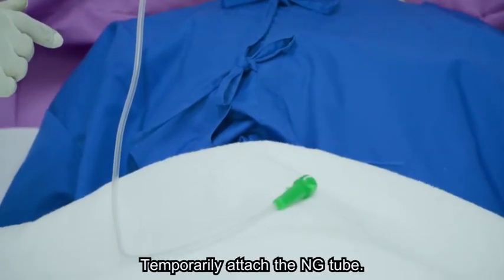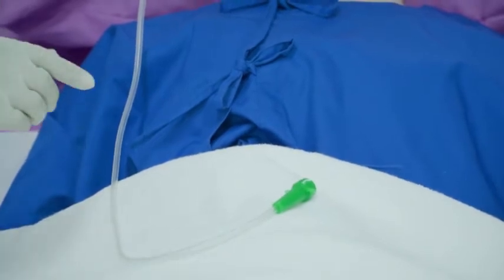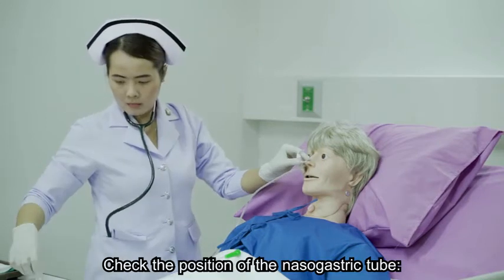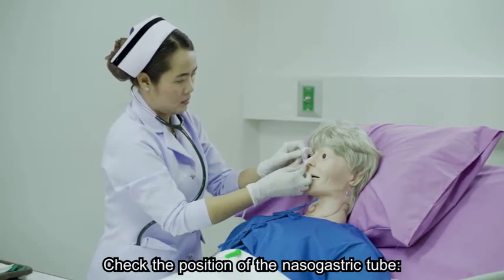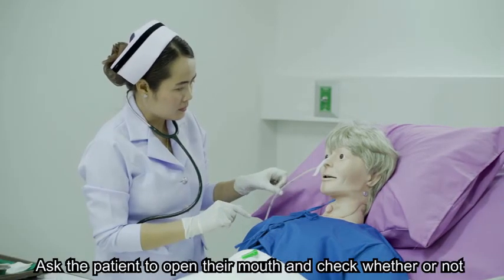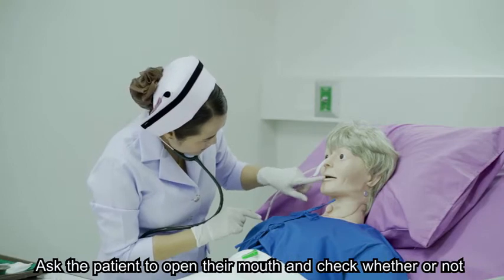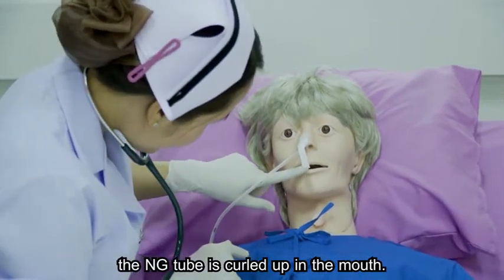13. Temporarily attach the NG tube. 14. Check the position of the nasogastric tube. Ask the patient to open their mouth and check whether or not the NG tube is curled up in the mouth.